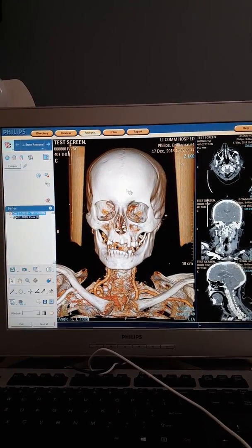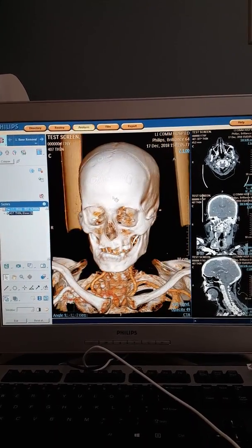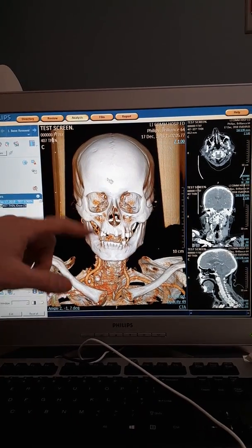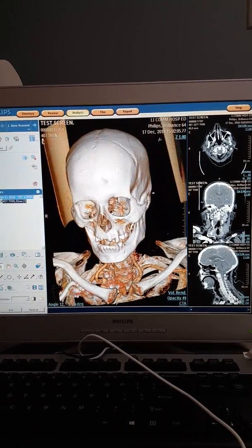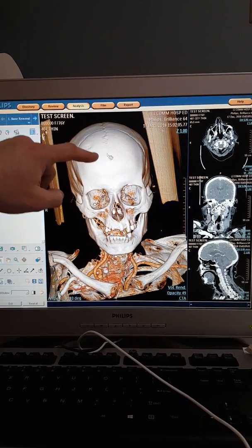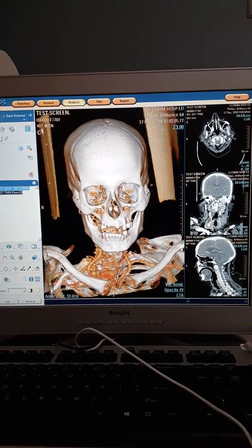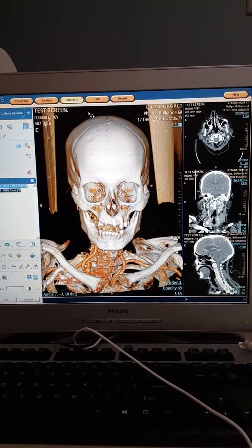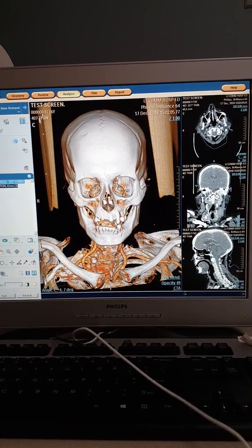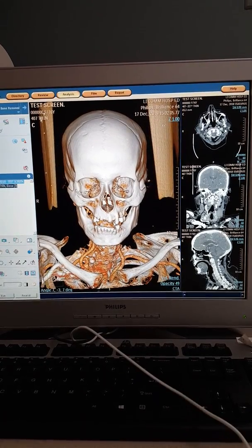First, you want to center the head so that you're working with something easier to work with. The atomic sign will let you move up and down, left, right. If you move up you can see the atomic sign changes to a circle, allowing you to go side to side. You want to make sure the person is looking at you, just about like that.